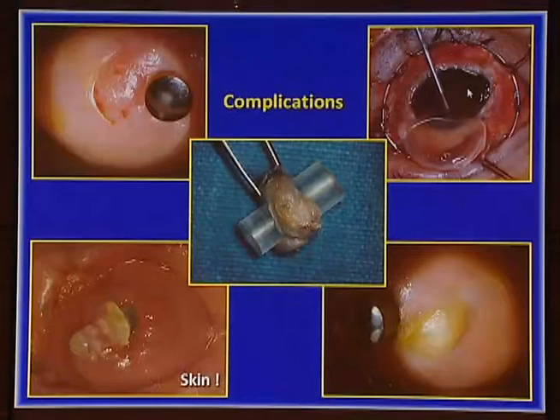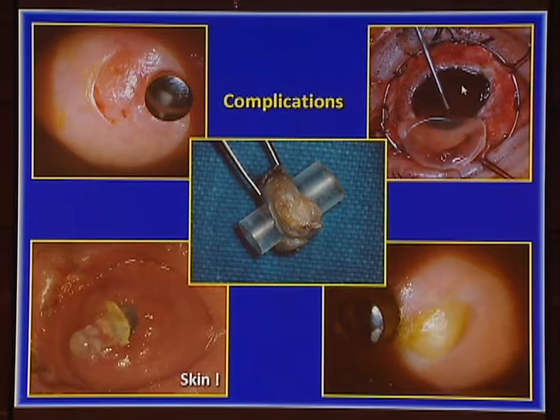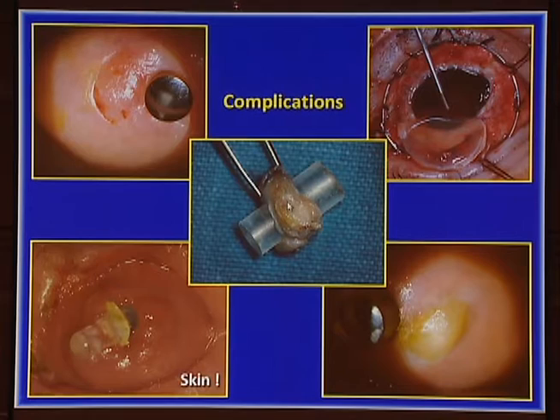Complications: there are many and all can be treated. The important thing is that they are detected early and treated by a capable surgeon. If these are detected early and well treated, very often most of these complications can be cured. We see an erosion of the buccal mucosa just near the cylinder. This was an endophthalmitis. We are doing a vitrectomy after having removed the implant. We see reabsorption of the lamina. Expulsion in a case of skin covering.